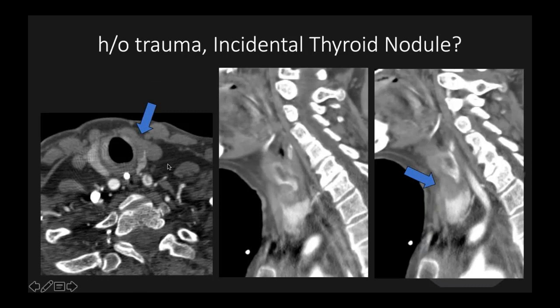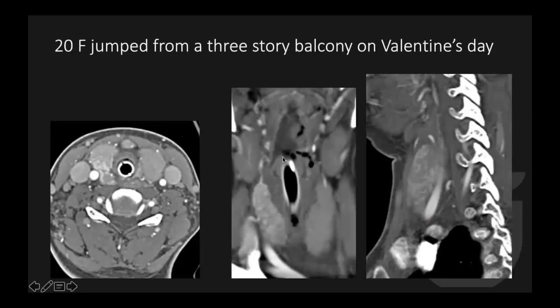Another trauma patient on CTA head and neck showed a hypodense lesion in the anterior left thyroid gland. But looking carefully, the patient had a dissection flap in the common carotid artery extending to the external carotid artery, which occluded the superior thyroid artery. So this is an infarction of the thyroid gland from superior thyroid artery occlusion — it can mimic a thyroid nodule.